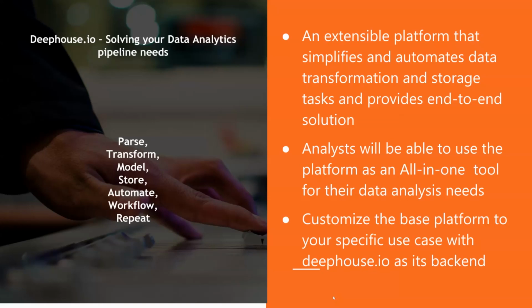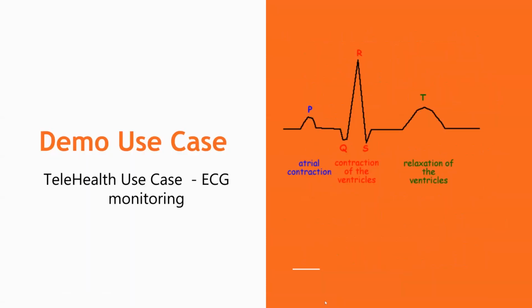We have a large vision of making all this self-service so you can take it, use it for your use case, use it as your backend service engine for analytics, or use it for exploration or testing. Folks, data, as we all know, will only get larger, and use cases will only increase in number. DeepHouse.io is starting its journey to end analytics design chaos.